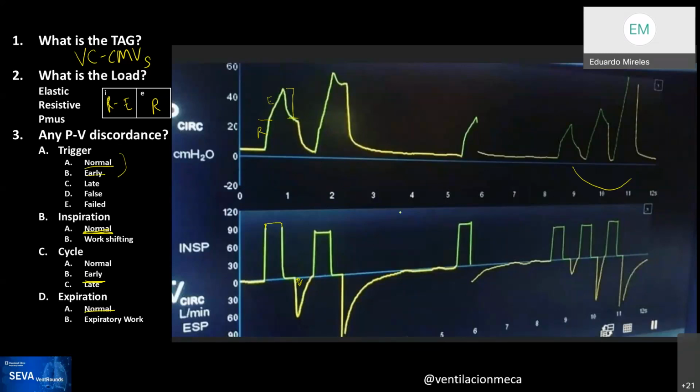So what are you exactly trying to target? Yeah, so there's two questions in this. One is what's triggering, and the second one is why is this flow changing, right? What's the target? Rob, any comments here, and then I'll show one slide.